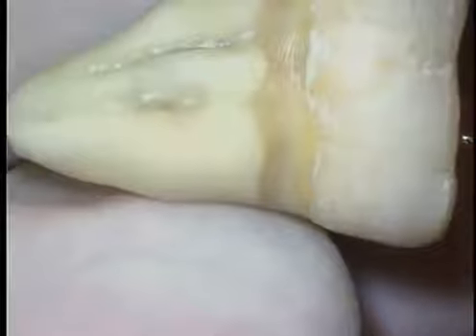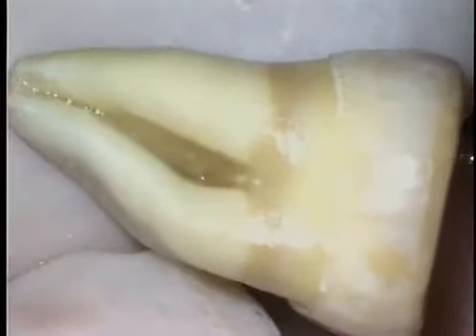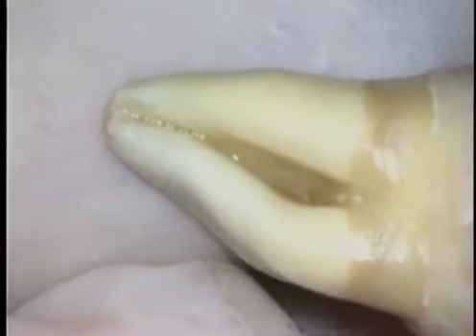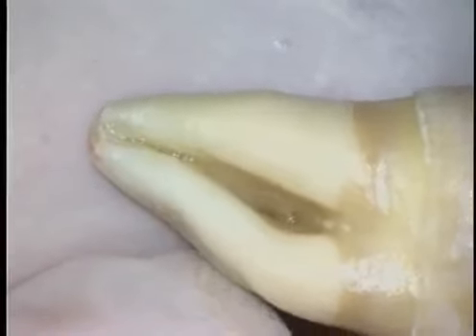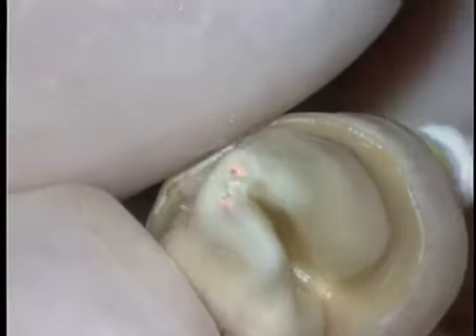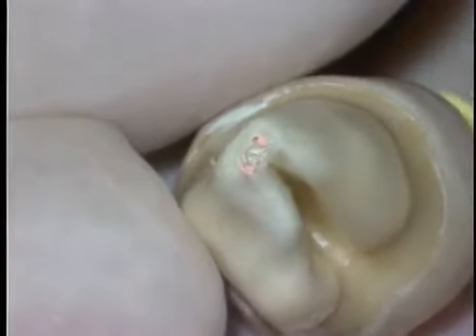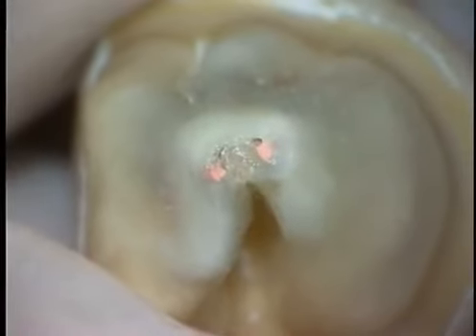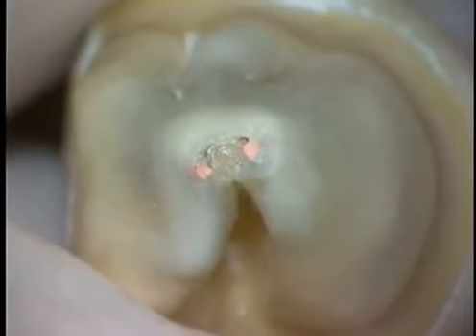Notice the fused roots. Notice that as we move down towards the apex and turn the tooth around, we see the cul-de-sac furcation towards the lingual aspect. If we look right up on the end of the root, you can begin to see within the sheath or isthmus that follows the configuration of the root, there's gutta percha at the extents of this fin. Notice the dead space in between the two gutta percha points. Therefore, many times, the pulpal floor anatomy reflects the anatomy that we see at the end of the root.